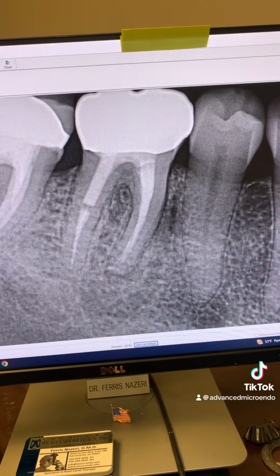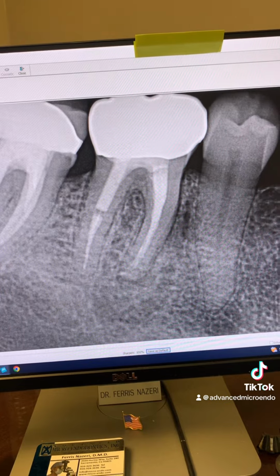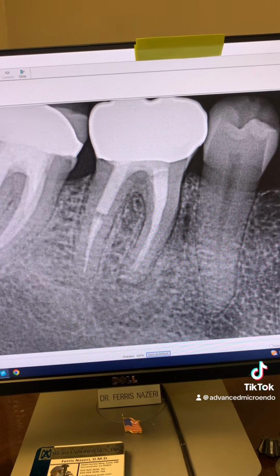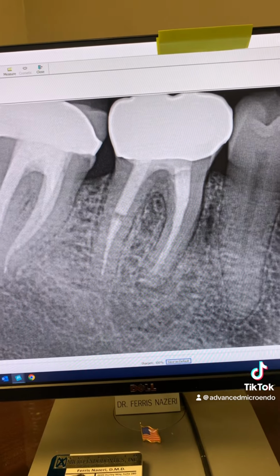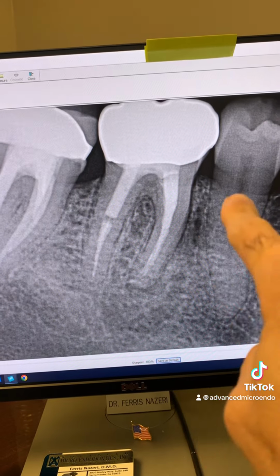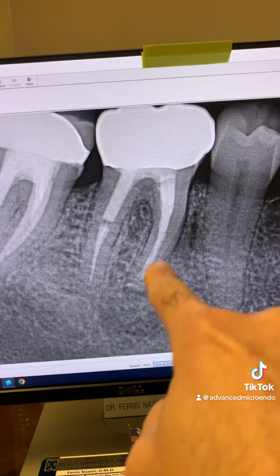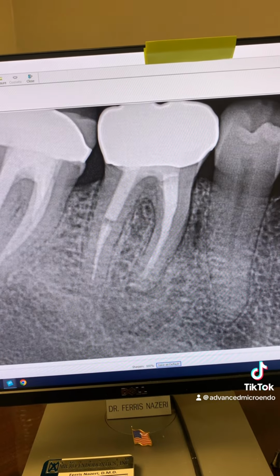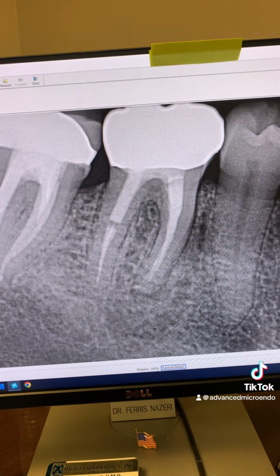Because of the thinning of the dentin. When you use Gates-Glidden drills, you just remove so much dentin, and over time, that remaining thin wall just cracks, fractures. As you can see, no periapical lucencies here. But the problem is right there. You saw the sinus tract on the lingual. I probed the tooth, actually. Probed 3 to 5 millimeters all around.